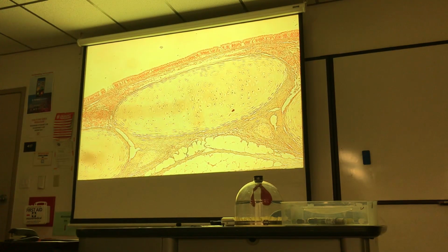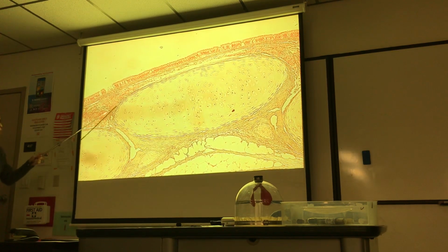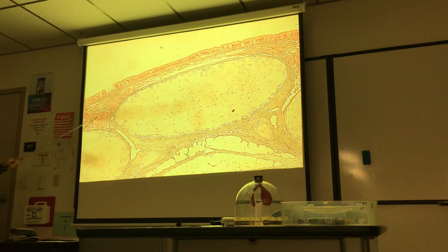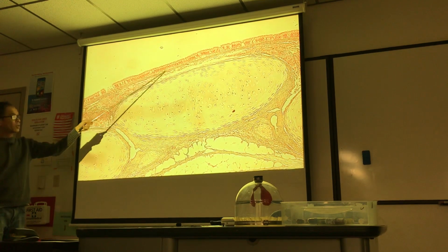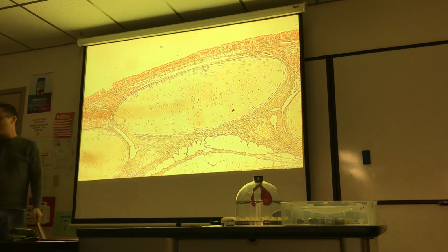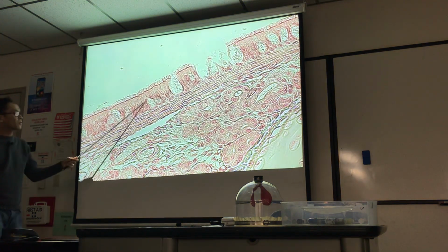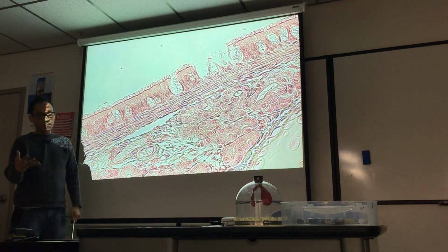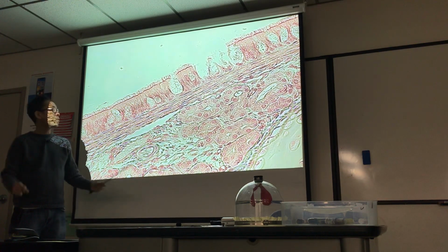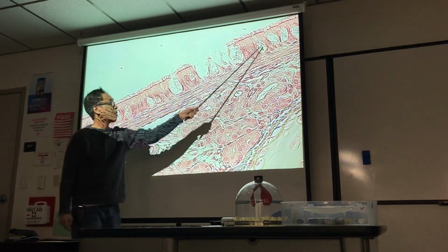I did cover the tracheal wall, adventitia. You remember what the gap from here to here is? Submucosa. And this is mucosa. Now for the details, I have to go to higher mag. I may have you identify this tissue. It's a ciliated, pseudostratified, columnar epithelial tissue with goblet cells. There's a lot of them there, some there. They're all along here.